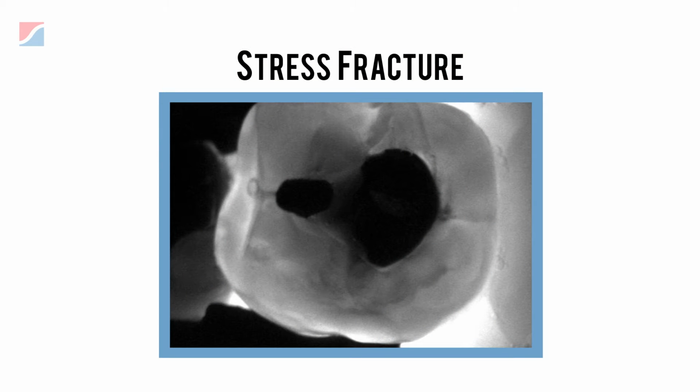This is a typical example of a posterior tooth fracture. Stress fractures and cracks will also be displayed, but as a lighter colour, not necessarily black. The ones we'd be concerned about would be these.